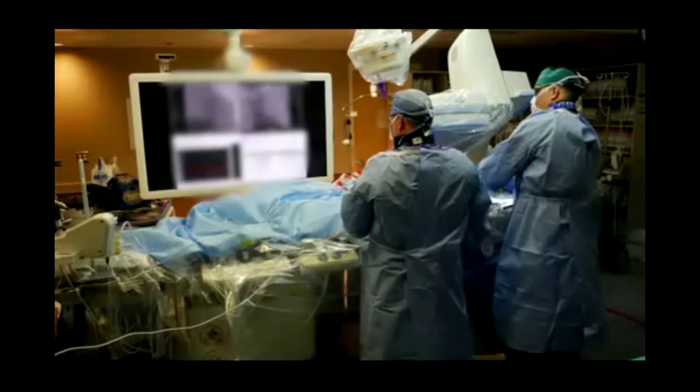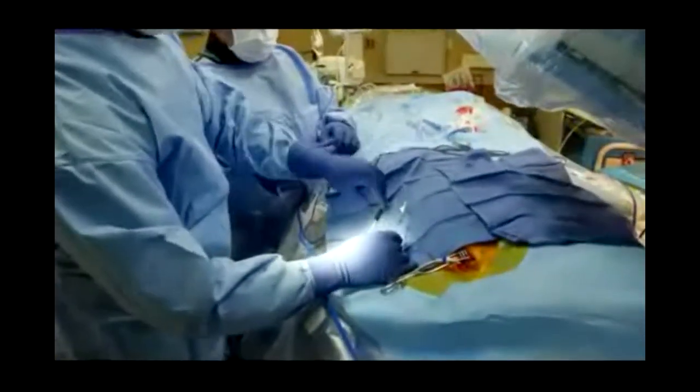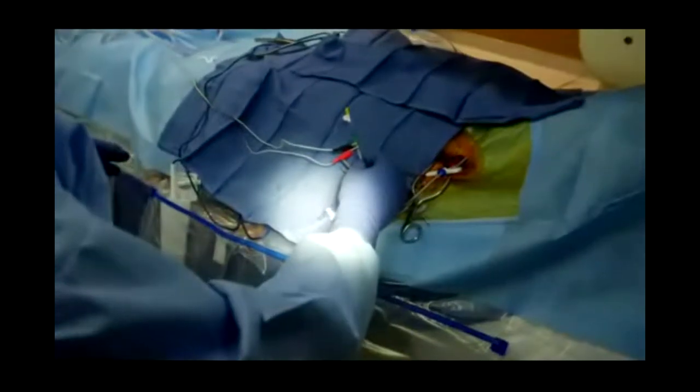Here we are making final adjustments. We're sensing the myocardium. We want adequate sensing. We ensure that lead is septally directed in the LAO view. We then remove that curved stylet, placing adequate slack on the lead so that it rides up nicely over the tricuspid valve annulus, being careful to make sure that the shock coil is completely beyond the tricuspid valve and won't interact with the valve annulus in any way.